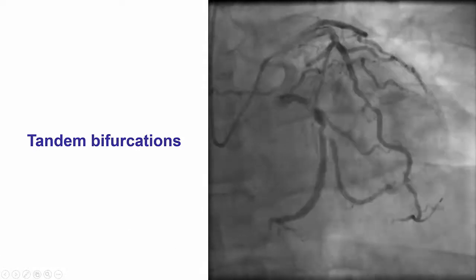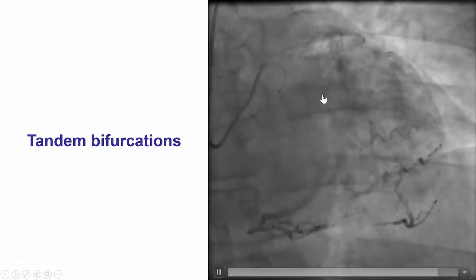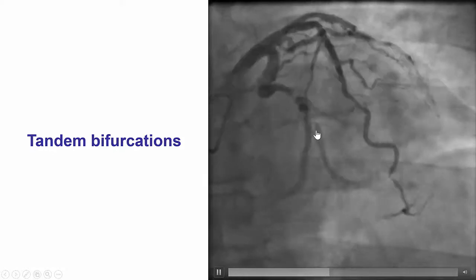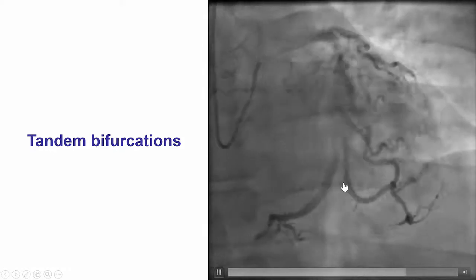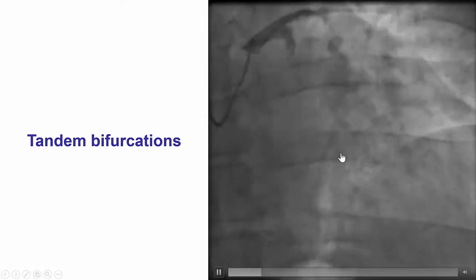This was the case of a patient with a significant circumflex lesion. It was actually two tandem bifurcations between the first and second obtuse marginal branches from a large left-dominant circumflex.